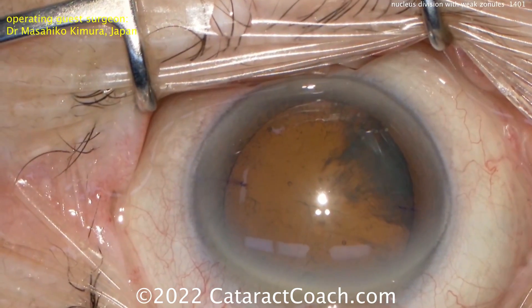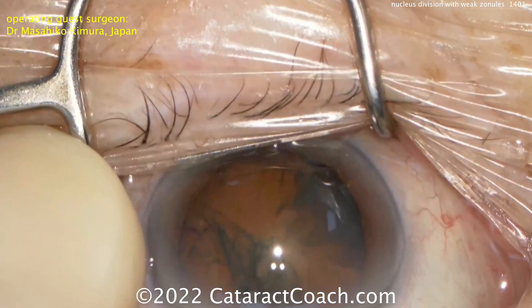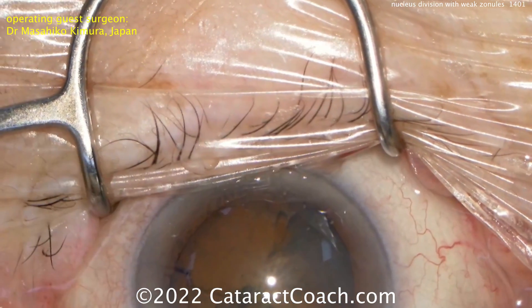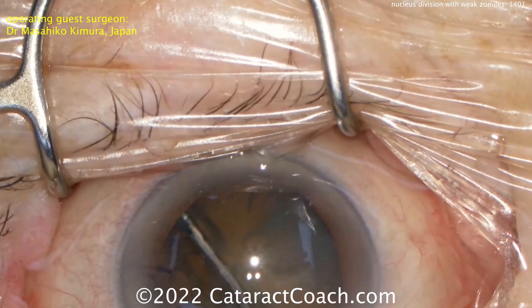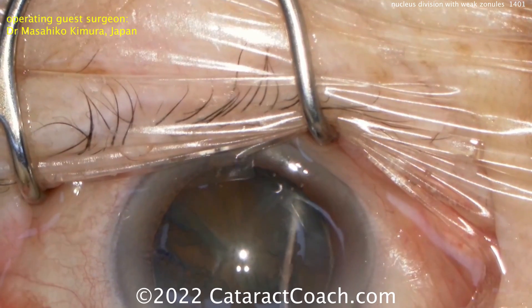Care must be taken in this case to get a good capsulorhexis and to assess the degree of zonular laxity. So in this case, the surgeon is going to do just a hydro delineation, then use a pre-chopper to split the nucleus into multiple thin strips, which can then be removed. At no time during this is nucleus rotation needed.